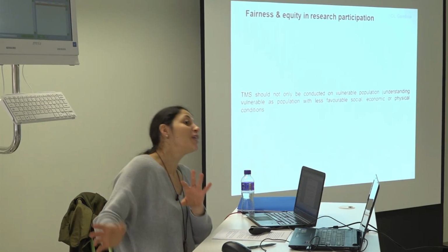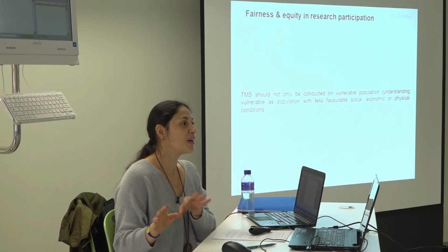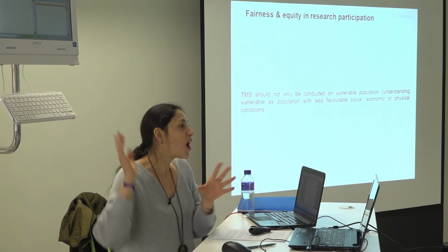So I need to do my TMS, and I know that it will be easier to go to the student population that have no money, and I only go to them because they will do it for some money to go out or whatever. No, that's wrong. You need to advertise to everybody. If people want to come, it will be because they want to come and not because they need the money, you know? Which I have had.